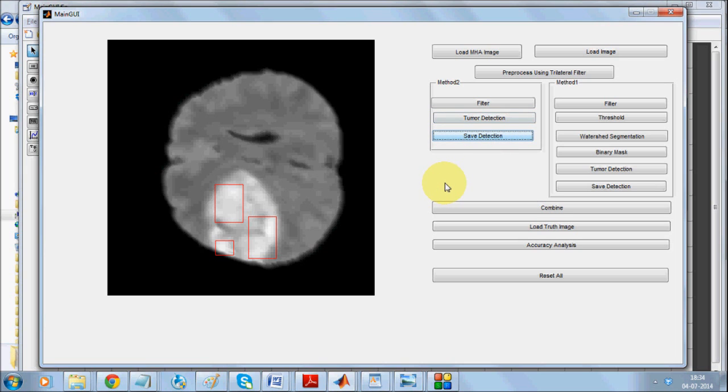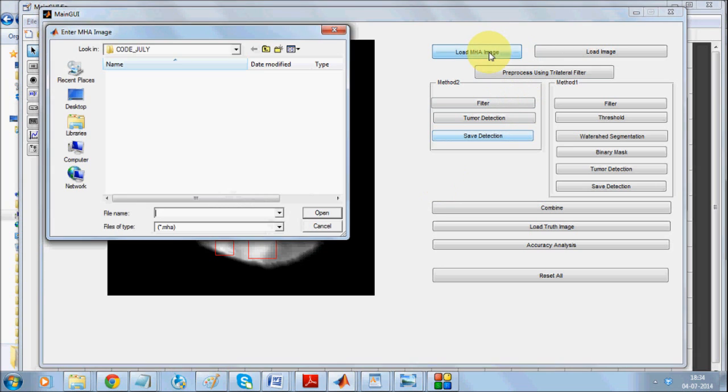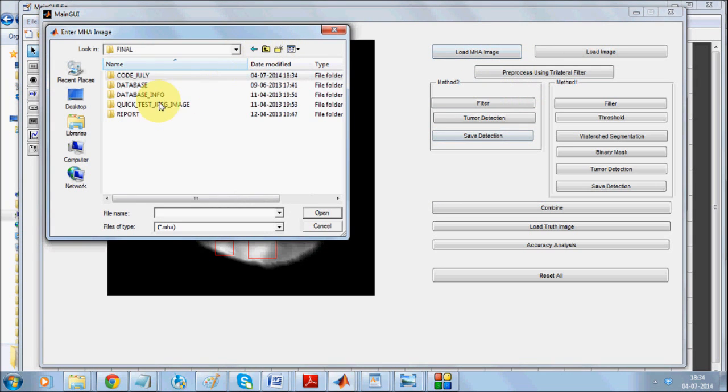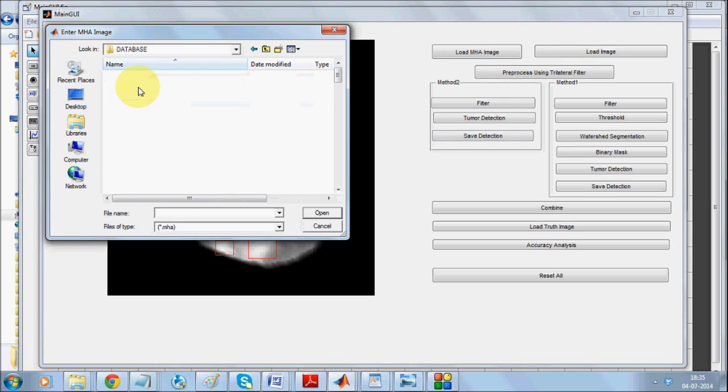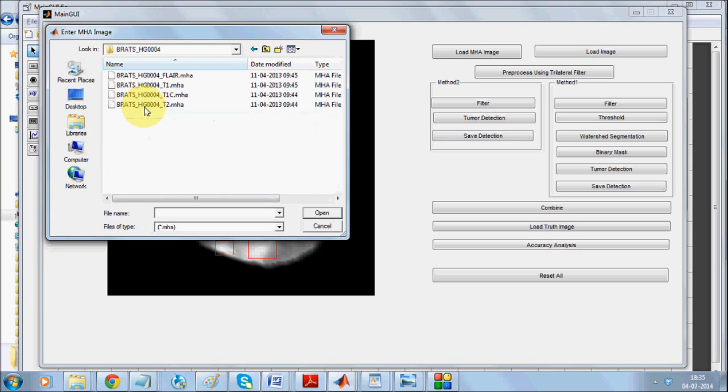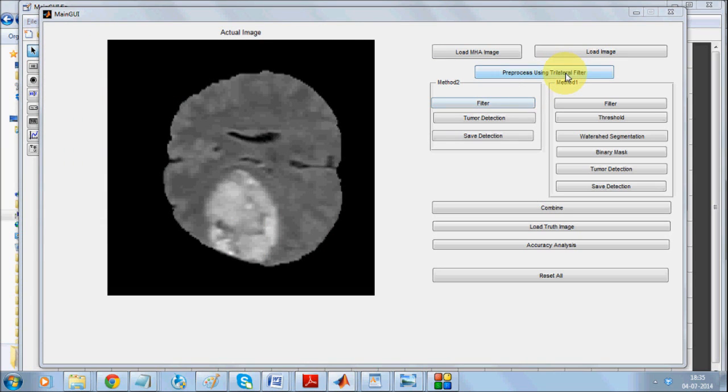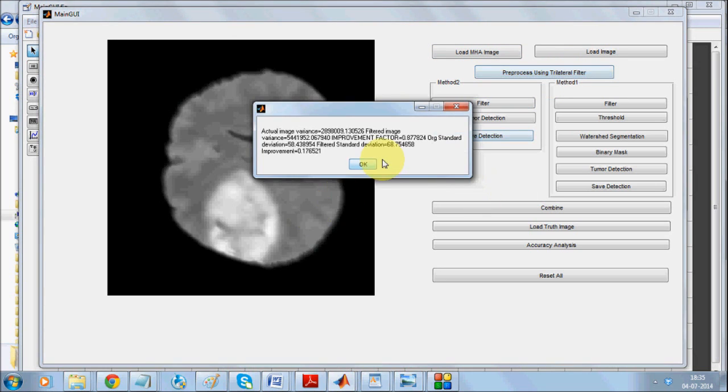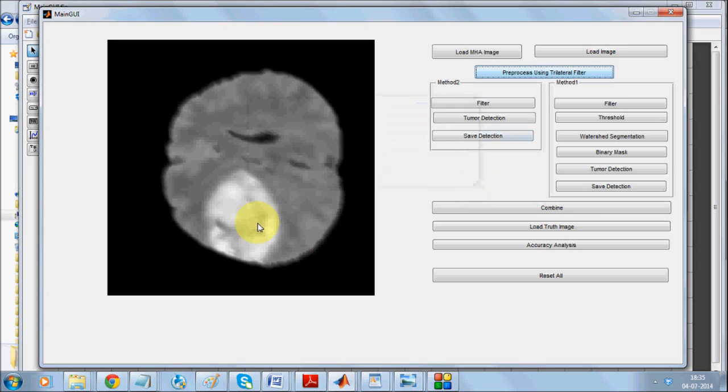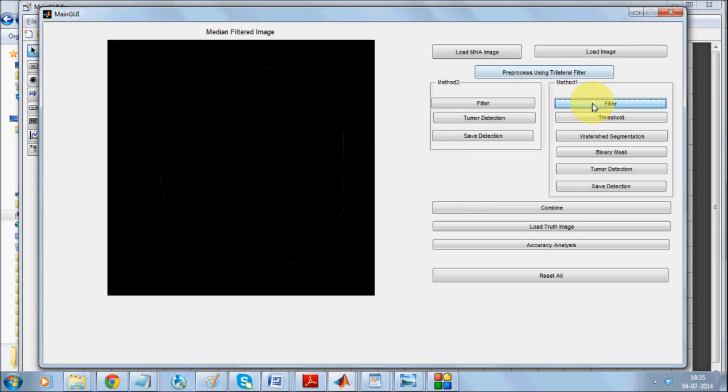We will once more load our fourth image. This is our fourth image. We will apply the trilateral filter which is consistent for both methods. It makes this region much more prominent and the neighbors much more unclear.